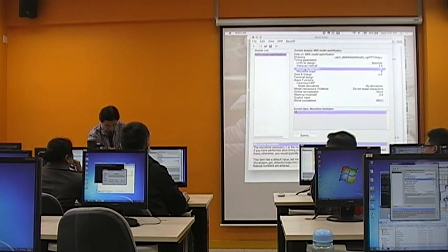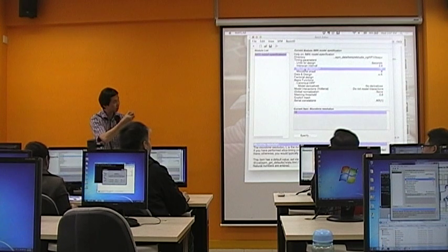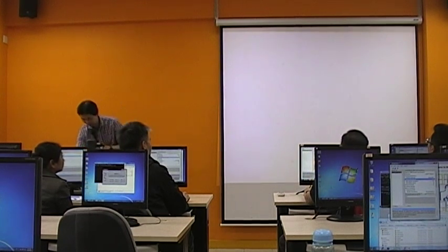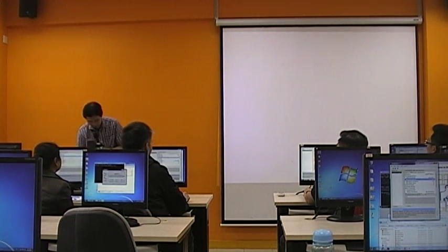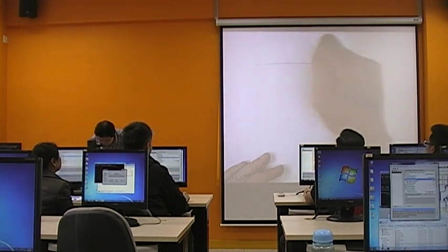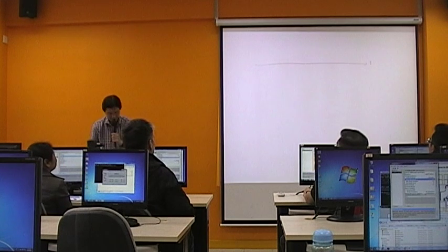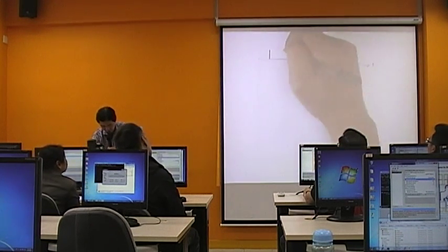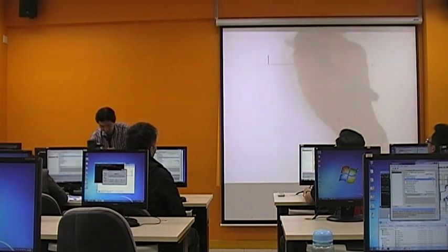So let me just try to use more multimedia in this case. Remember that this is the time domain. You have your onset of events. Let's say we are doing some kind of event-related design.